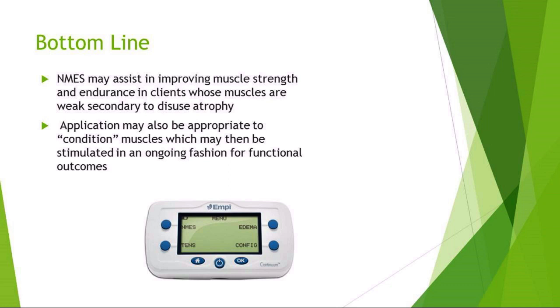This is a picture of the portable NMES unit that we have in the lab. You'll see this in clinical settings a lot. You can do NMES or TENS or some other applications using this same unit, and we'll get a chance to play with those in lab.